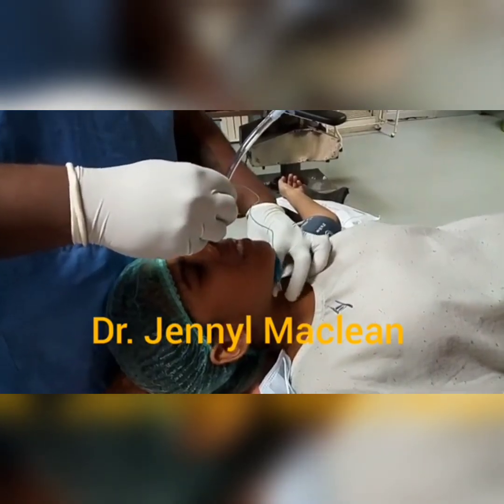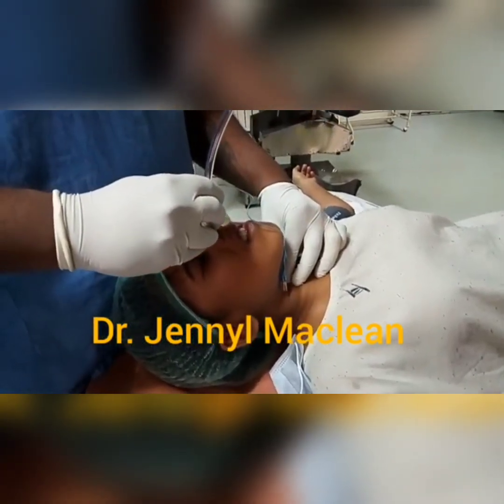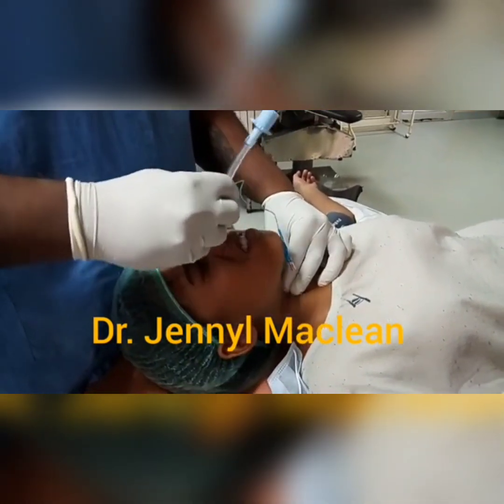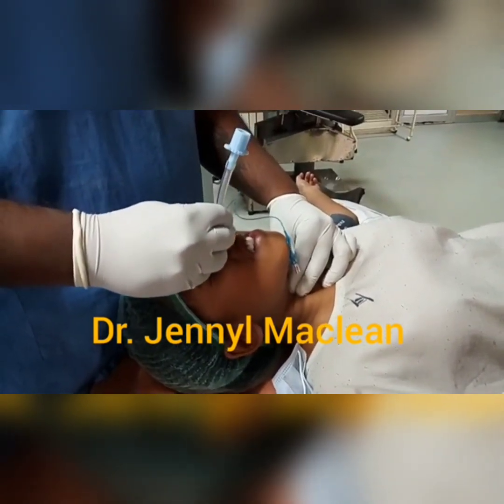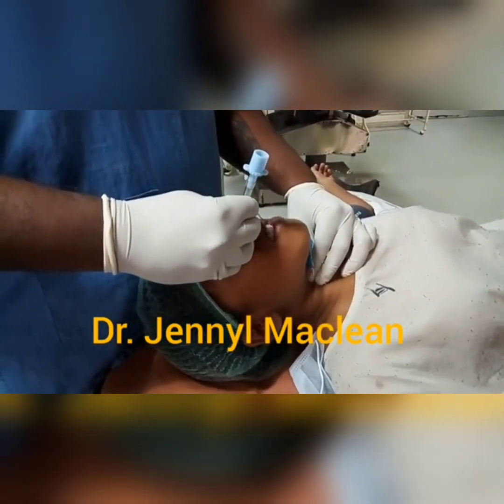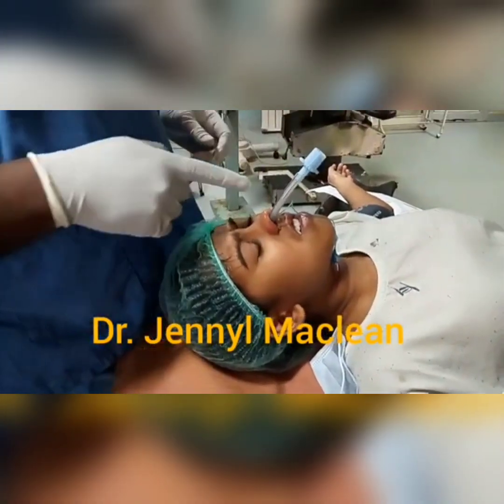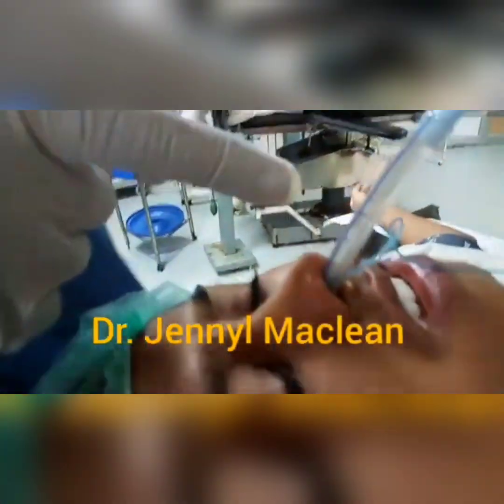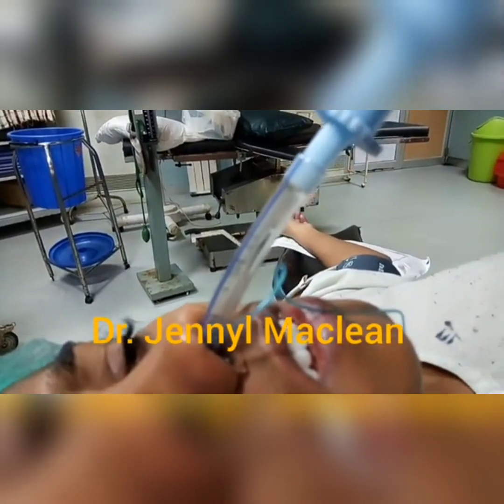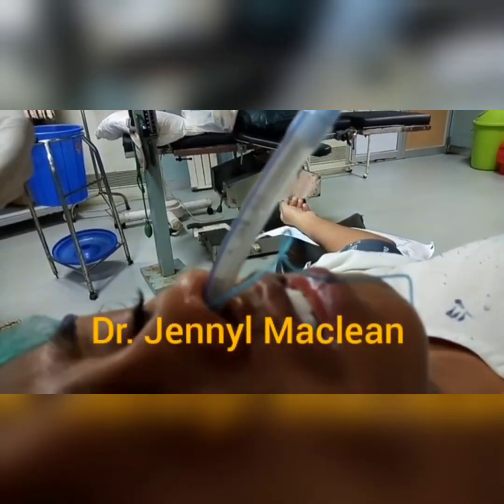After doing airway blocks for the superior laryngeal nerve and recurrent laryngeal nerve, and using nasal jelly also, you can see here I am slowly introducing a 6mm endotracheal tube for an 18-year-old girl. Make sure the patient is breathing. As you introduce, you can see when the endotracheal tube enters — you can see the fogging at the endotracheal tube. You can also attach an ETCO2 to confirm that the endotracheal tube is past the glottis.